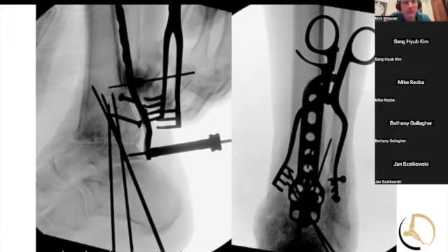Experience with the Zimmer total ankle where you go from the side? A little bit. It's been a minute, but yes, I've done maybe 15, a number of years ago. I always wonder about some patients, whether they're high risk incisions, but then I worry, I've only seen the ones that have gone bad, so I'm biased, but they've developed fibular non-unions and have had issues.